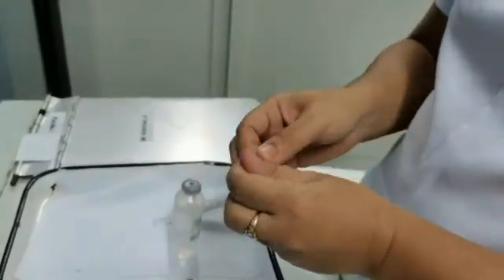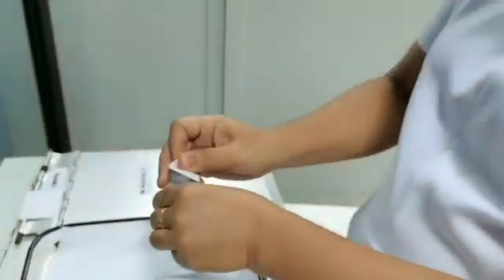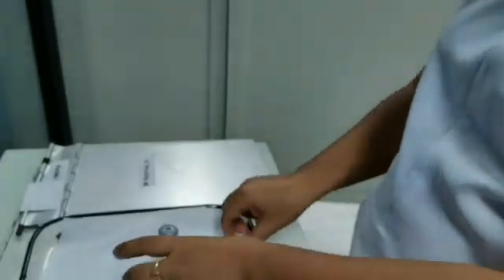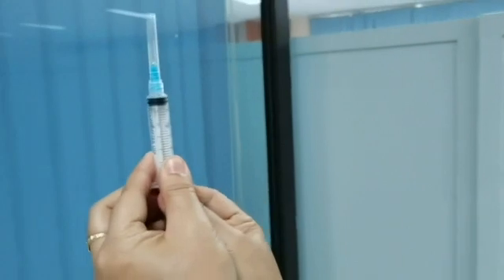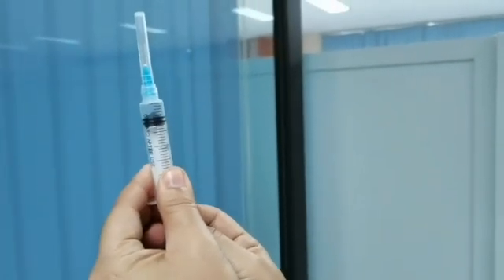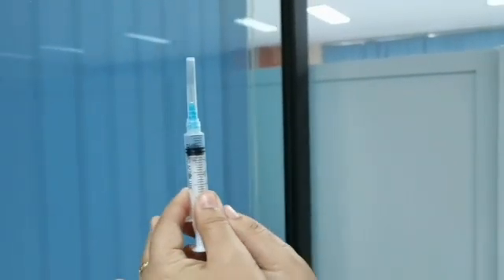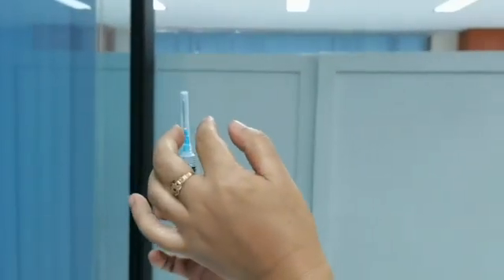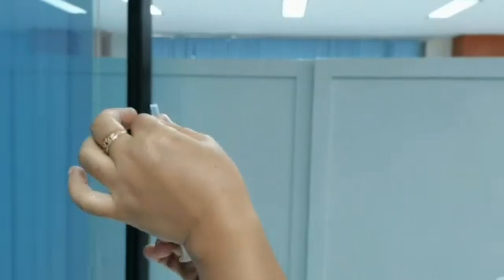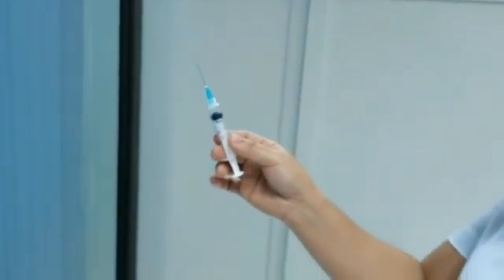Pull end of plunger back to fill syringe with a volume of air equal to the amount of solution to be drawn up. Do not touch the inside of the plunger. Remove needle cap and needle if necessary.